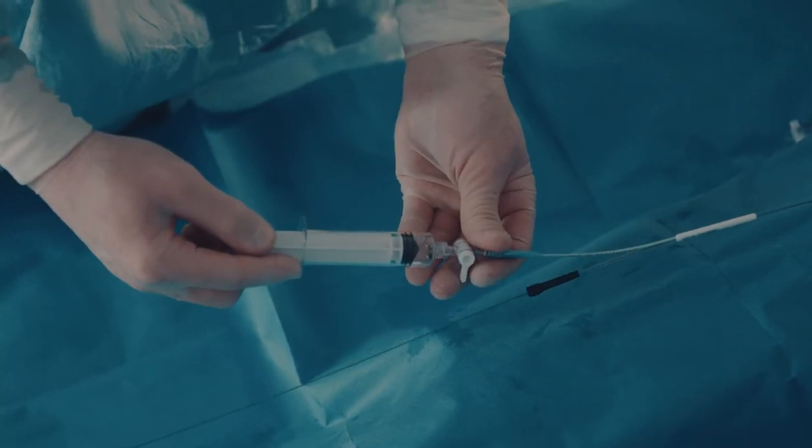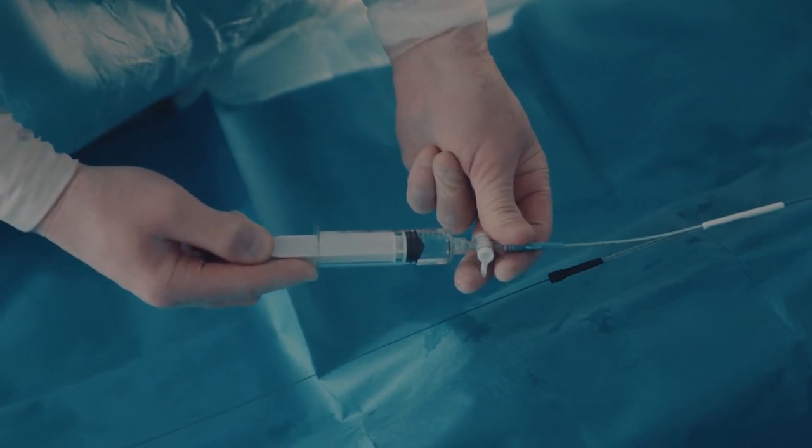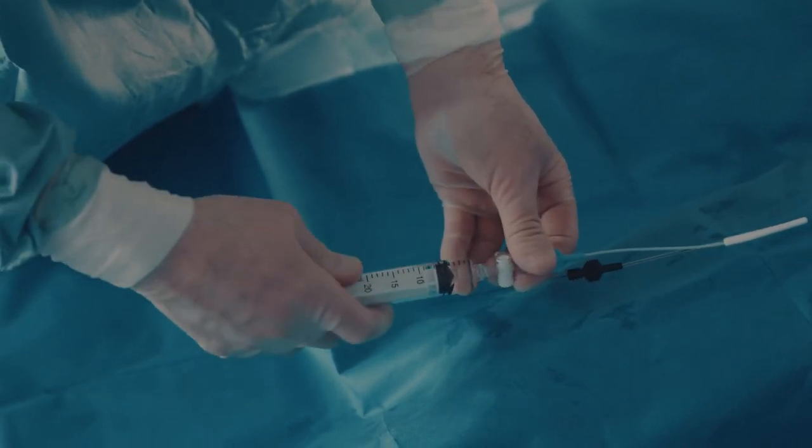To deflate the Reboa balloon, open the stopcock and apply suction with the syringe. Be patient — this may take up to 30 seconds in a 15x30mm balloon due to the small bore of the 6-French compatible shaft.